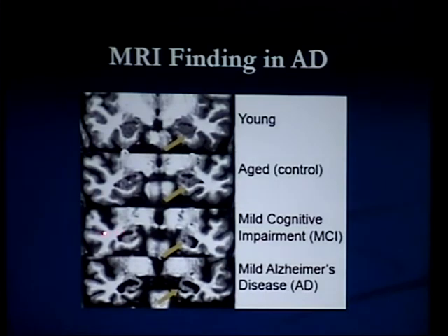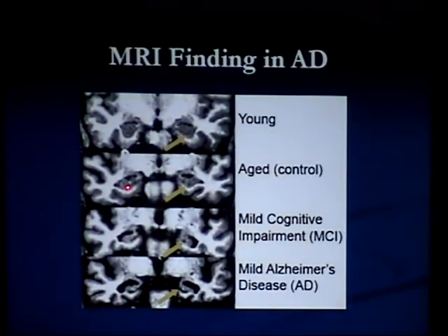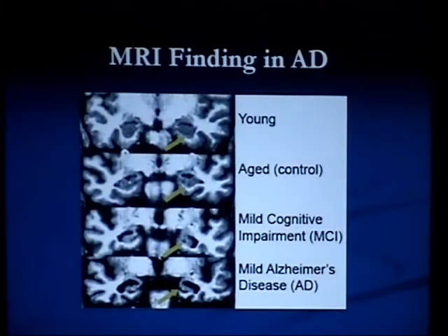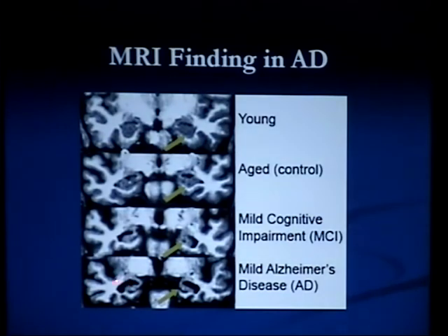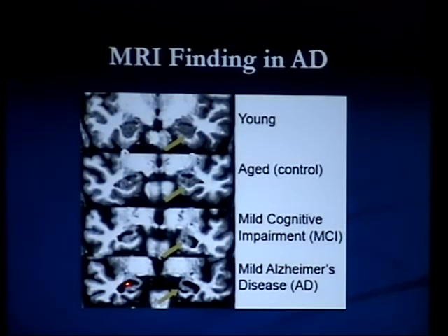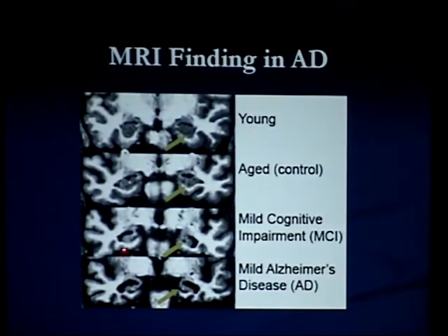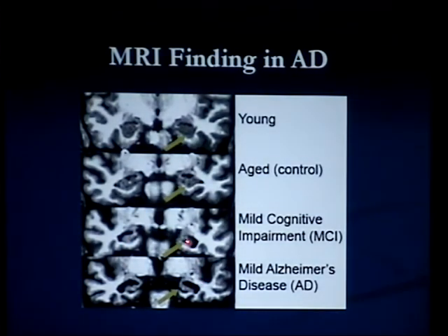But you can certainly see that there's more space here, more black here, than you see on this MRI. And then when mild Alzheimer's disease is diagnosed, you can see that these structures are even more atrophic. So if you just compare this black space here to the black space here, which is that temporal tip, you can see that there's a big difference.